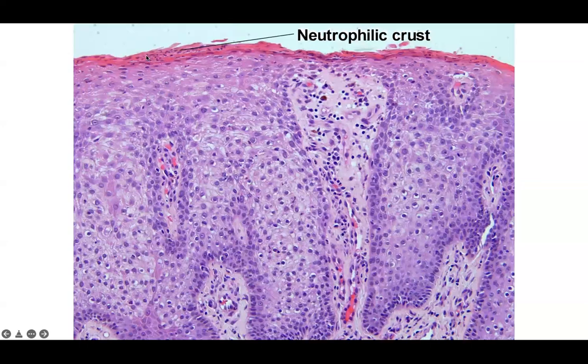And in those areas where you've got neutrophilic crust, diffuse parakeratosis, a diffuse hypogranulosis, suprapapillary plate thinning, it looks a lot like psoriasis, doesn't it? So, but again, clinically, you'll know it's solitary. Usually psoriasis has more regular psoriasiform hyperplasia where you've got more rounded out rete ridges.